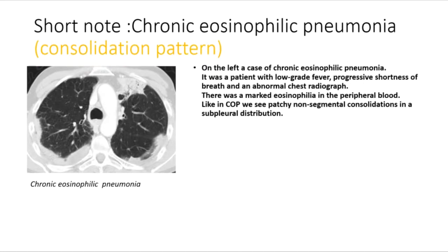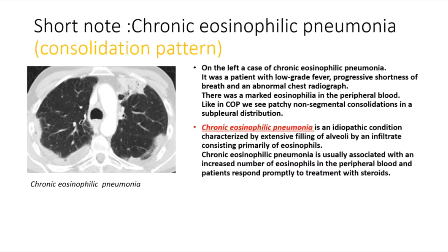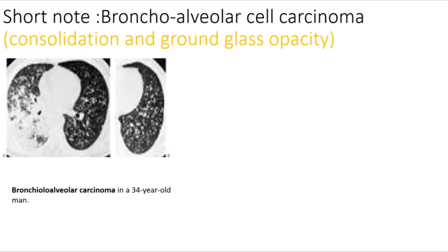A case of chronic eosinophilic pneumonia: a patient with low-grade fever, progressive shortness of breath, an abnormal chest radiograph, and marked eosinophilia in the peripheral blood. Like COP, patchy non-segmental consolidations are seen in a subpleural distribution. Chronic eosinophilic pneumonia is an idiopathic condition characterized by extensive filling of alveoli by an infiltrate consisting primarily of eosinophils, usually associated with increased peripheral blood eosinophils, and patients respond promptly to steroid treatment.